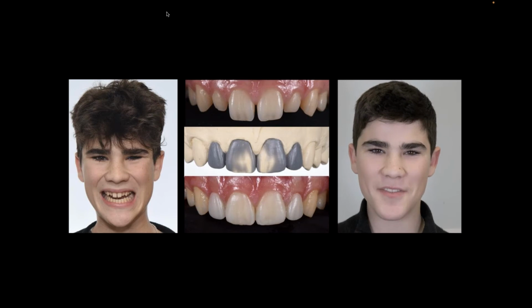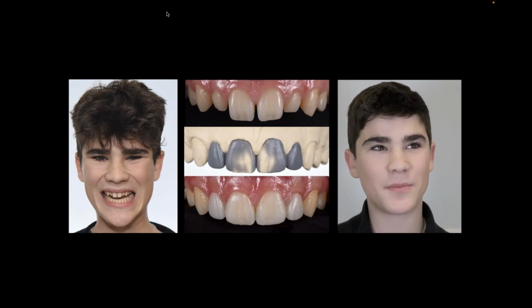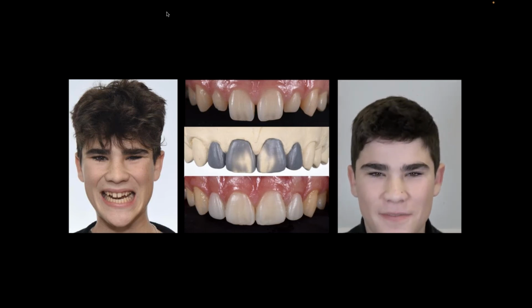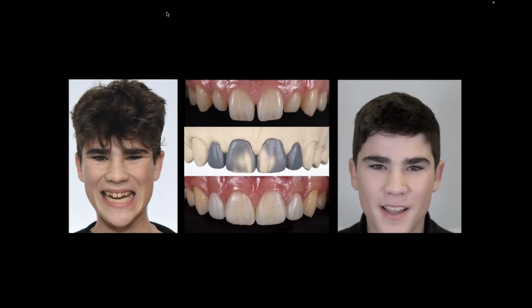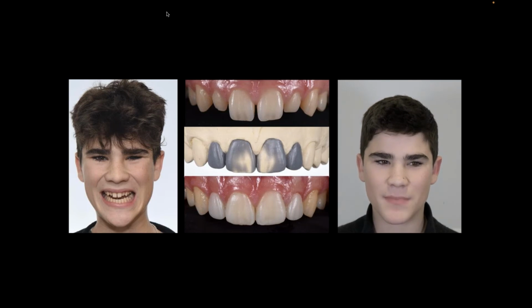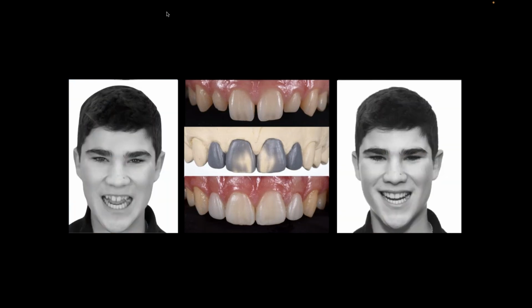And I think you can see right away as the patient starts talking and speaking, just with that little matrix in his mouth, already he feels better. And by the way, he looks older and more mature, right? But it's basically the same kid with a little bit of a different haircut. So those teeth in the face really mean a lot and really help us to make the patient feel comfortable.